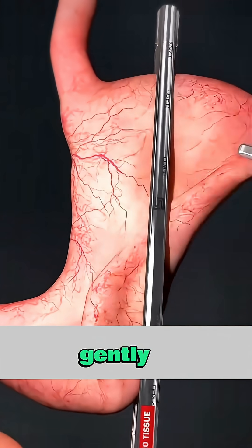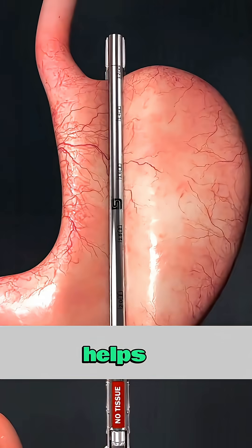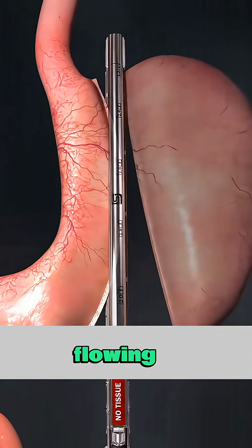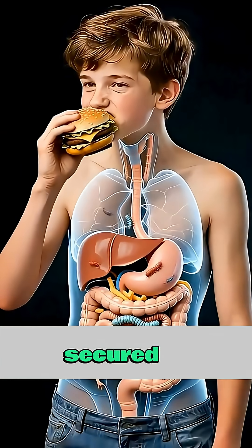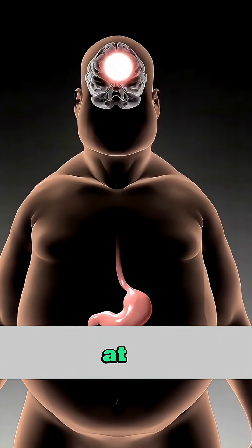The top of the stomach is gently folded and fastened around the lower esophagus, creating a new valve that helps prevent stomach acid from flowing back up. The folds are secured with tiny fasteners, all done internally — no incisions on the skin at all.